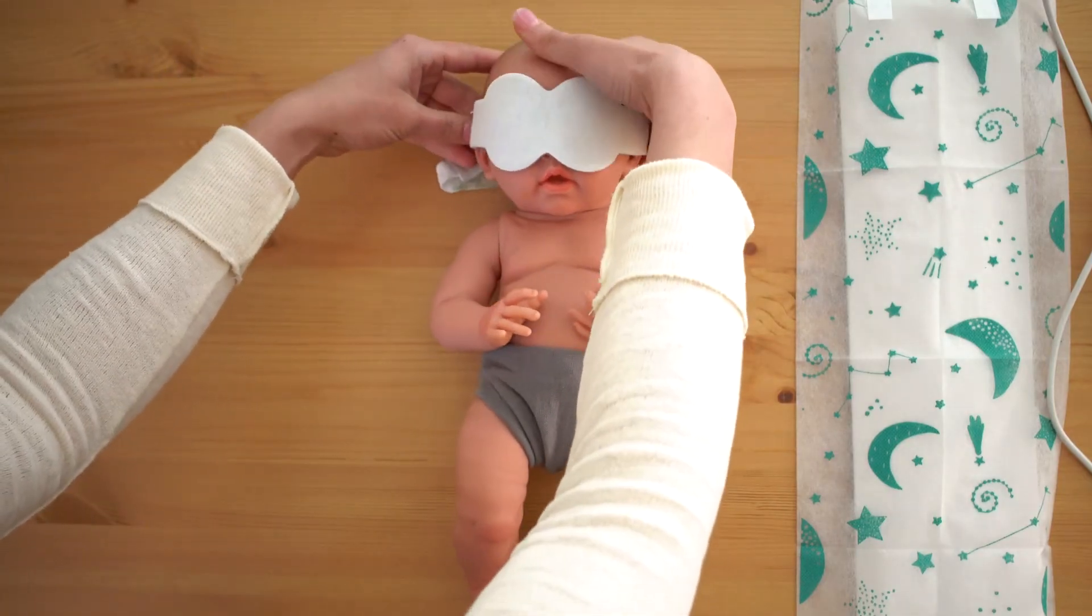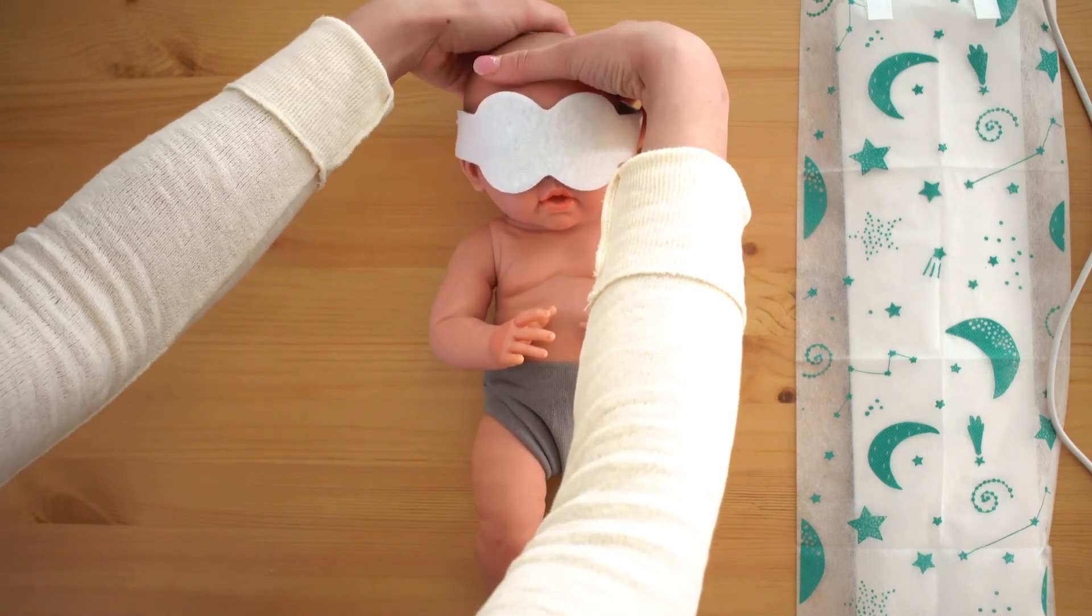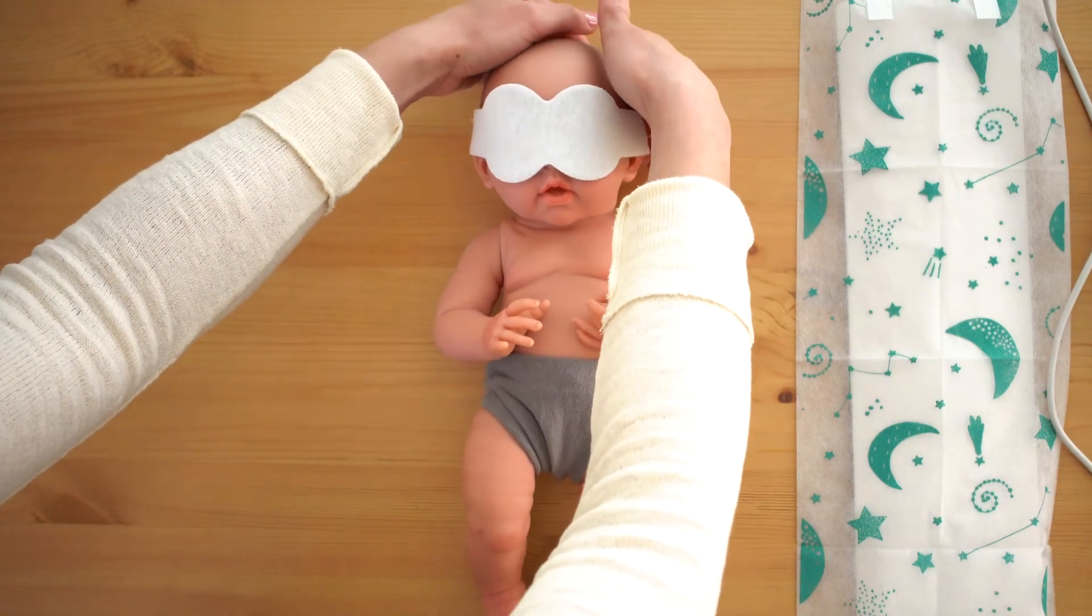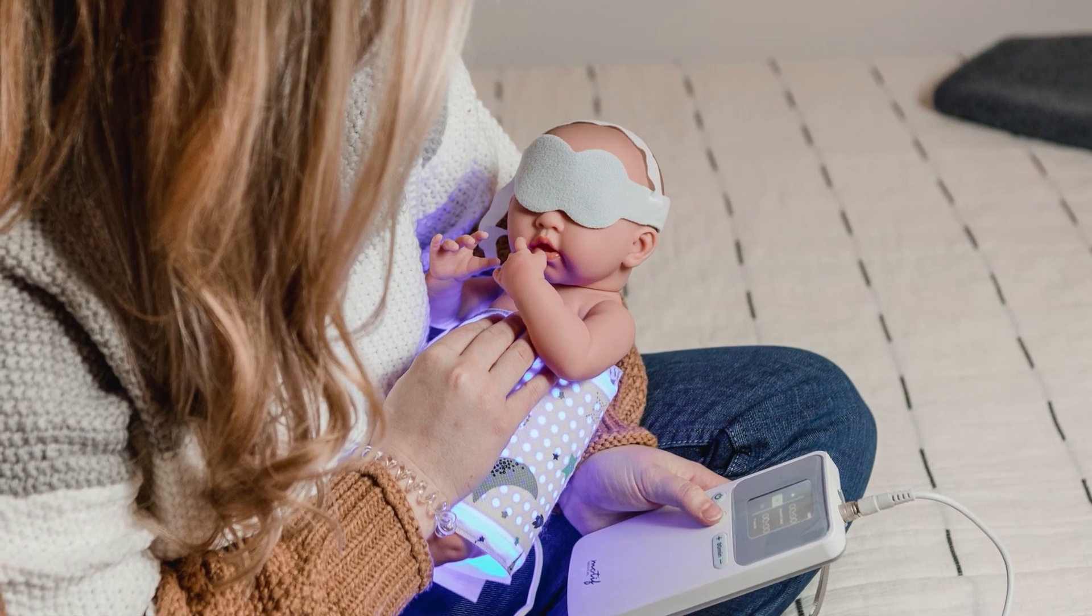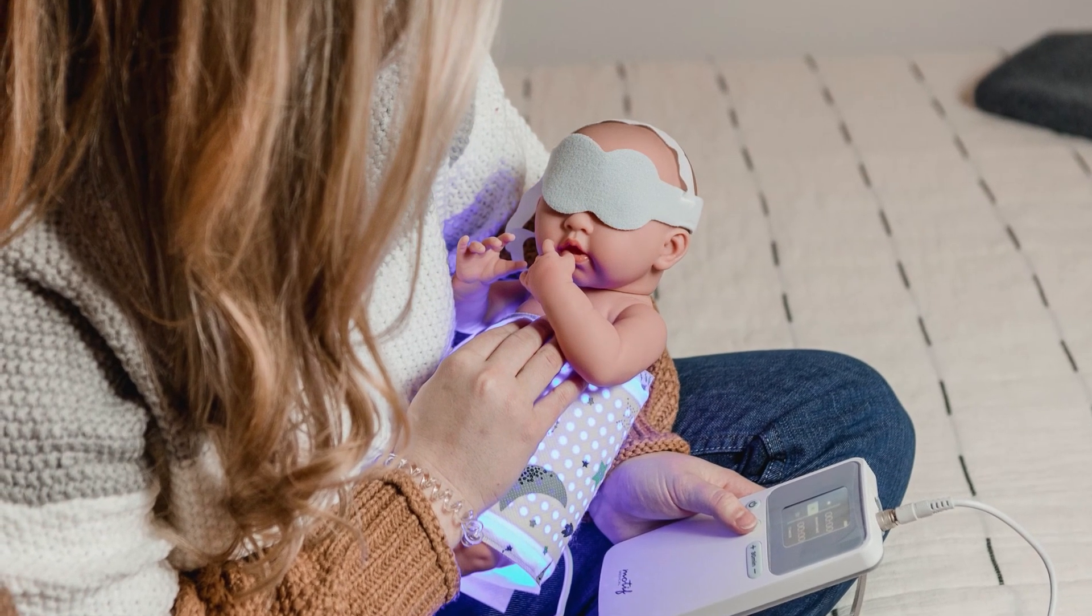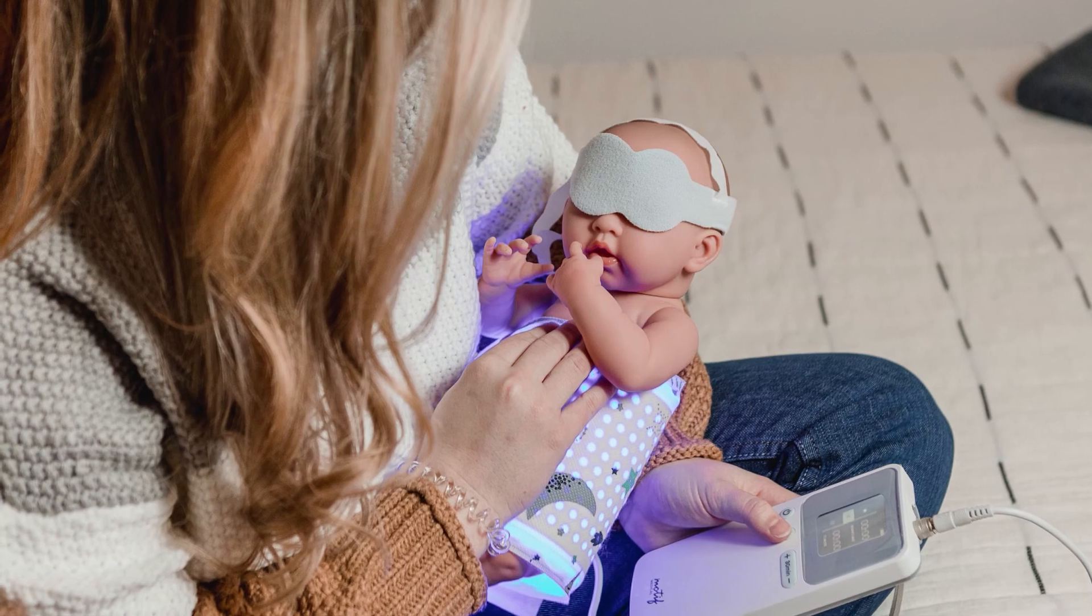Next, place the eye protection on the patient's eyes. Once the Billy Touch is properly assembled and the eye protection is on the patient's eyes, you are ready to use the Billy Touch.